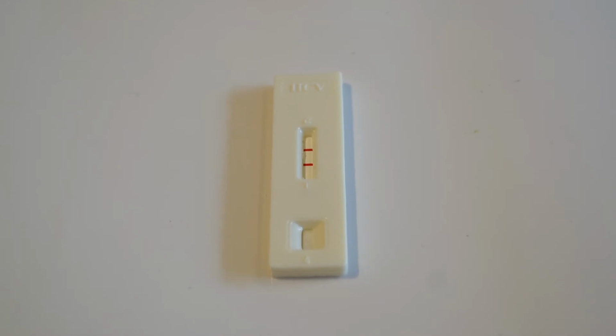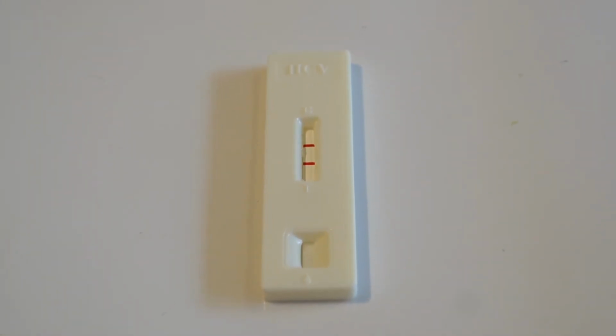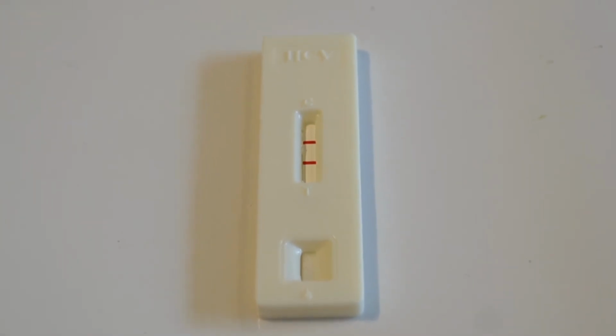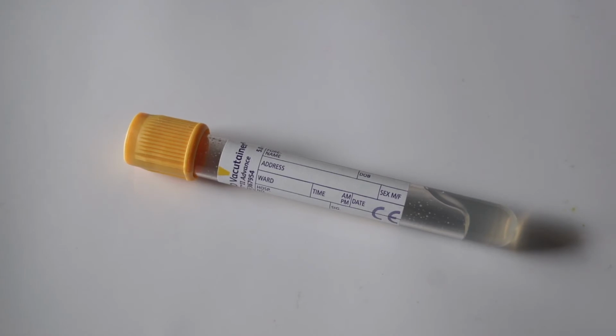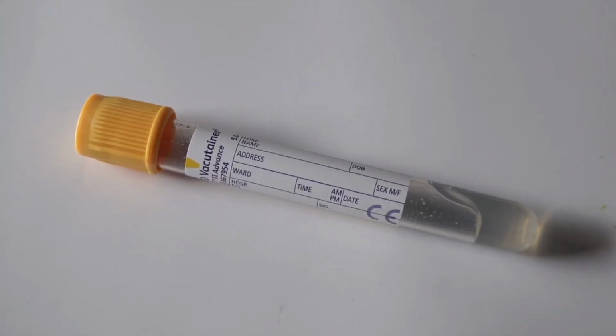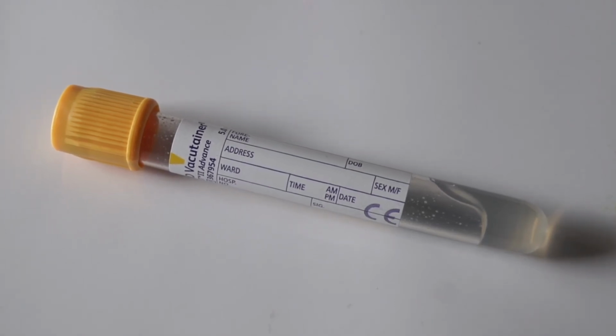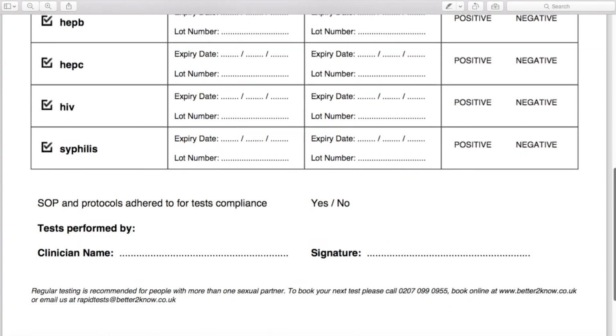In the event of a reactive test result for either HIV, hepatitis B, hepatitis C, or syphilis, a venous blood sample must be taken from the patient in a gold-top vacutainer. Please inform Better2Know, who will then send you a new pathology request form. This new form and the sample should then be sent to the laboratory for confirmatory testing. The instant test procedure has then been delivered.